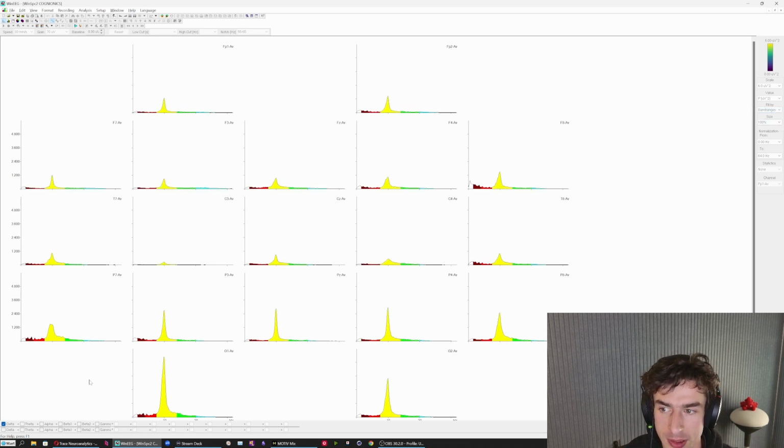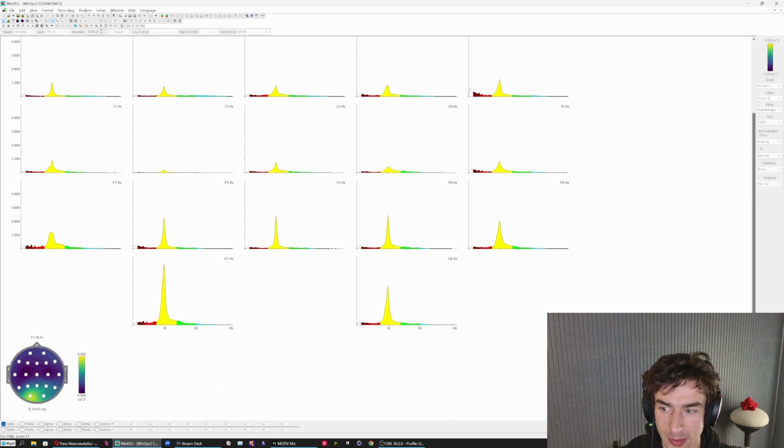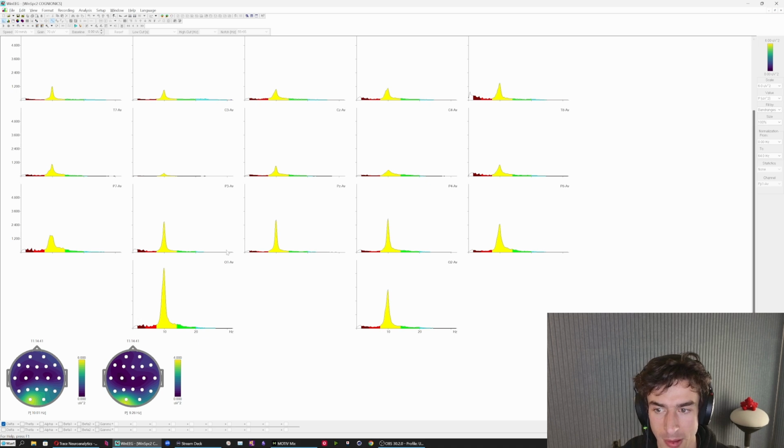And this is where we start to see that really the left temporal region is operating a little differently from everywhere else. If we pick out the peak at PZ, we see a nice 10.01 hertz. And at P7, there's this slower aspect. And the slower edge of alpha does tend to track ischemic changes. And O1 is really standing up, so we don't really see it, but you can see that there is this intensity of that slower edge of alpha here at P7.